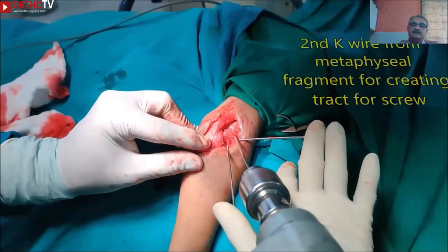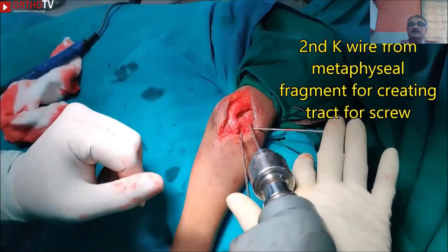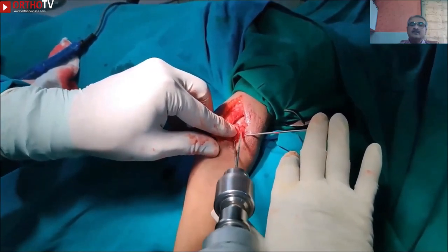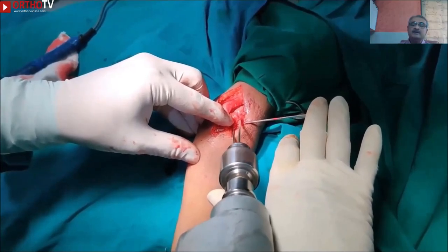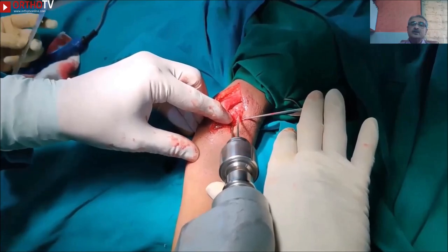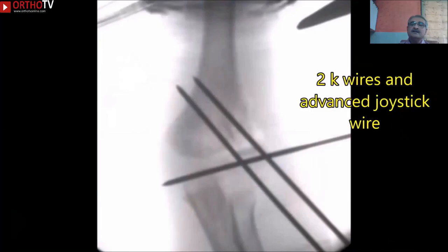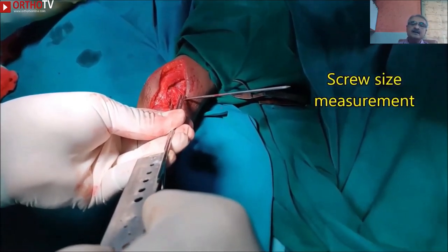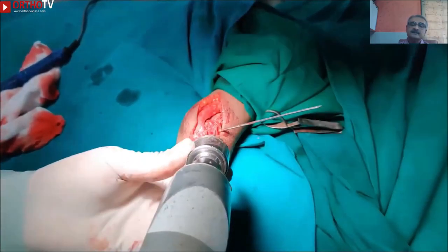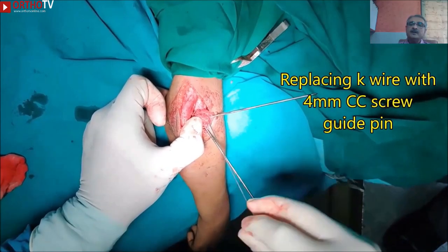The length of the wire can be checked by palpation. After this, the second K-wire is passed from the metaphyseal fragment of the lateral condylar fragment. This same wire creates a track for the 4mm cannulated cancellous screw which we will use for fixation. Once the K-wire is in place with bicortical purchase, an IITV check is done to confirm the correct position. After confirming the K-wire position, measurement of the screw size is taken with a same-sized K-wire. The K-wire is then replaced by a guide pin for the 4mm cannulated cancellous screw.